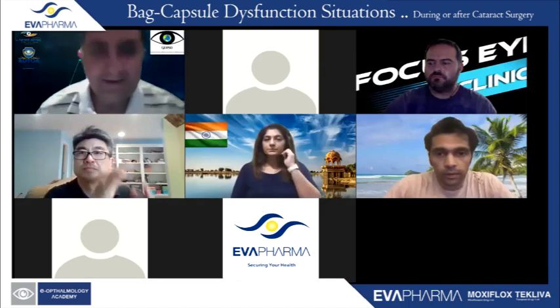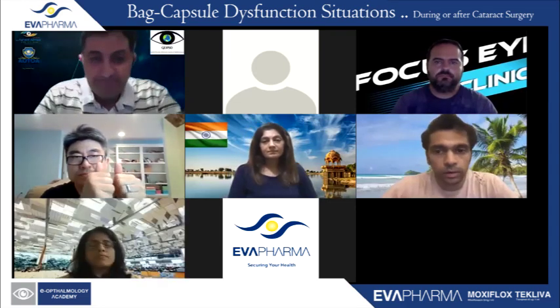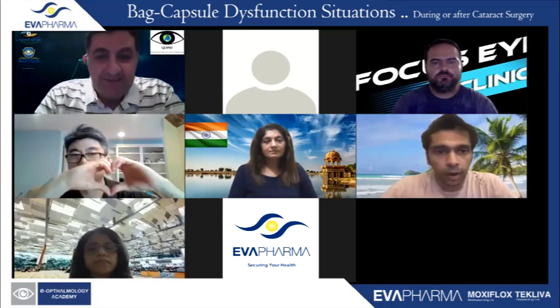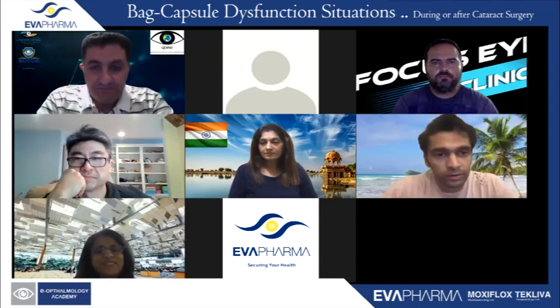Thank you, Ashraf. I think that was brilliant. Excellent cases that you've shown there, and I think the way you handled it was phenomenal. I would have to add, you make it look easy.